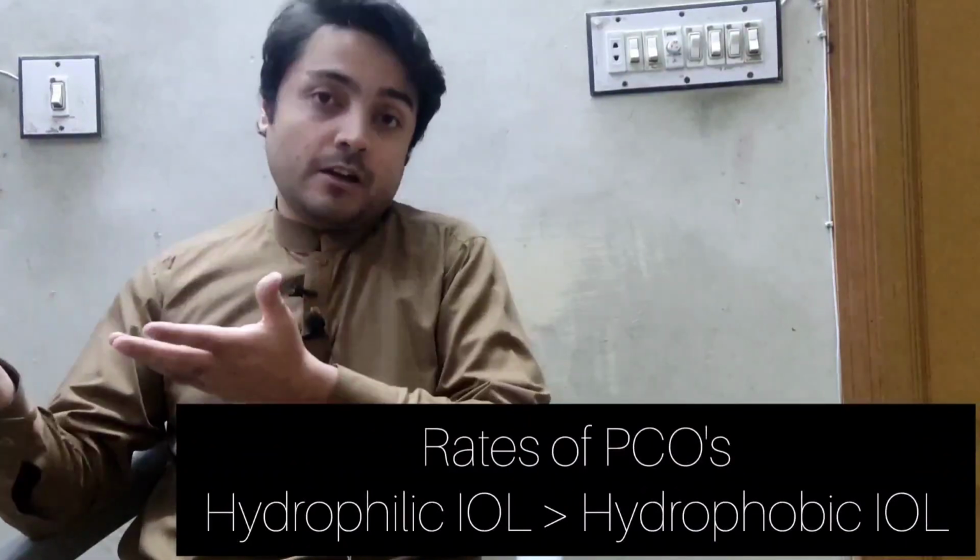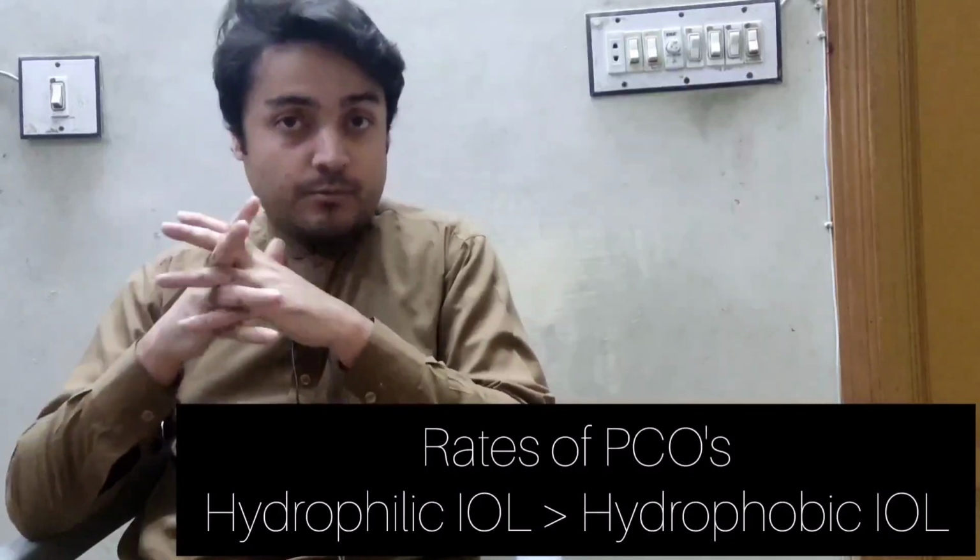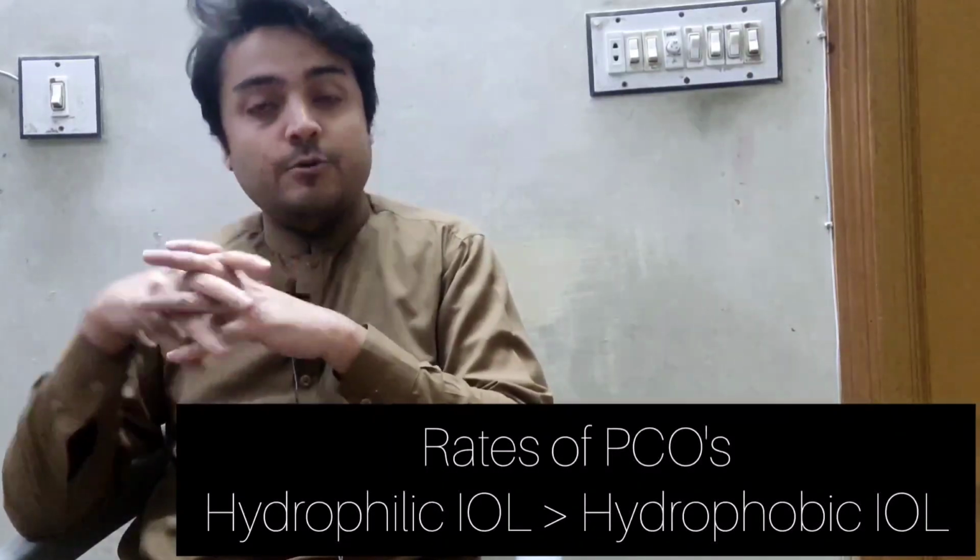Now how to stop them? Well, we cannot stop them. They do develop in almost 50% of the cases over a period of 5 years. But yes, hydrophobic IOLs are shown to have decreased posterior capsular opacities as compared to hydrophilic IOLs. Now, these are easily treatable as an outdoor patient in the clinic. It usually takes about 5 to 10 minutes.